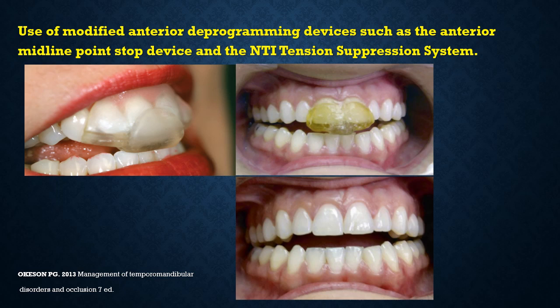And they believe that this device will suppress the headache or the trigeminal neuralgia, but actually it is not supported by longitudinal clinical trials. And it has the same drawbacks as the anterior deprogrammer, as the intrusion of the covered area and the super eruption of the uncovered segment are going to occur if it is used for a long period of time.